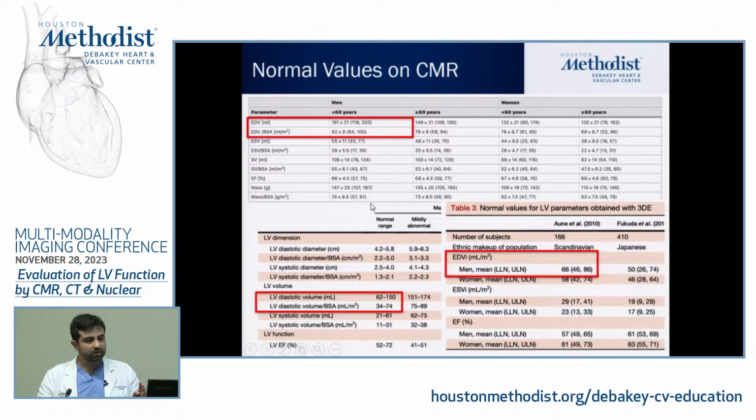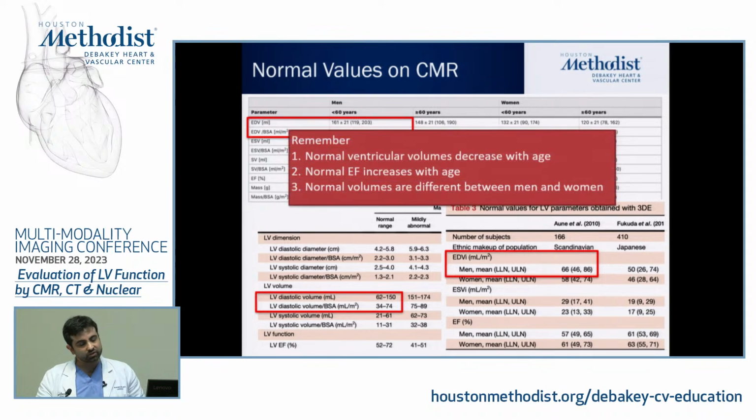But the end result is, if you underestimate EDV and ESV to the same extent, hopefully, you still end up with a similar stroke volume on echo as you get on MRI. The key thing is to remember your echo quality has to be good without foreshortening, and this is most applicable in a normally shaped heart without significant wall motion abnormalities. So as a result, your EF will also still be very similar between your echo and your MRI.